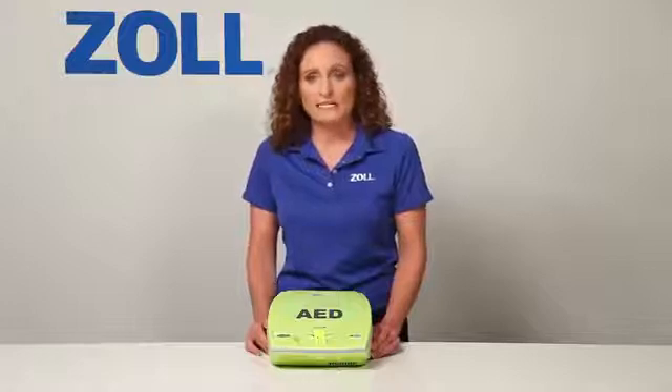Now, let me demonstrate the major benefit of the AED Plus. It provides the best support to someone who is rescuing a victim of sudden cardiac arrest. Most of what I will demonstrate is not available in any other AEDs.